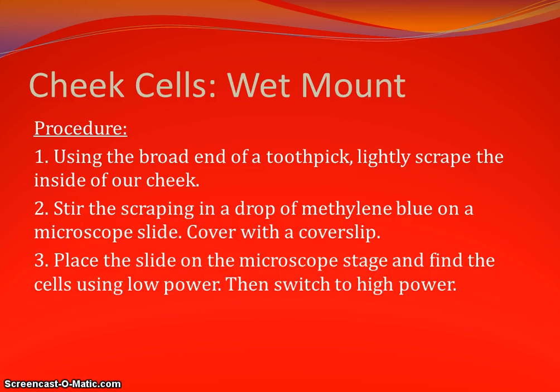In our lab, we observed cheek cells, and ours were from Navi, and we prepared a wet mount for them. So we used the broad end of a toothpick and lightly scraped the inside of our cheek, in this case Navi's. Then we stirred the scraping into a drop of methylene blue on a microscope slide, and then covered it with a cover slip, being careful not to produce any air bubbles. And then we placed the slide on the microscope stage, and using low power we observed it, and then we observed it using high power.